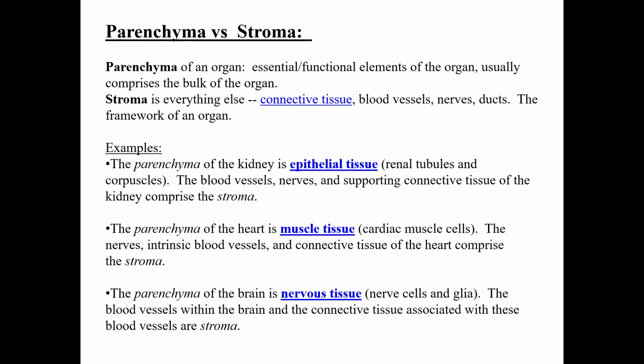stroma. Now, there are 9 different types of epithelia, but we will not cover those in this video. You can access your learning module for Histology Lab or read about the 9 types in the Big Picture Histology, Chapter 1.